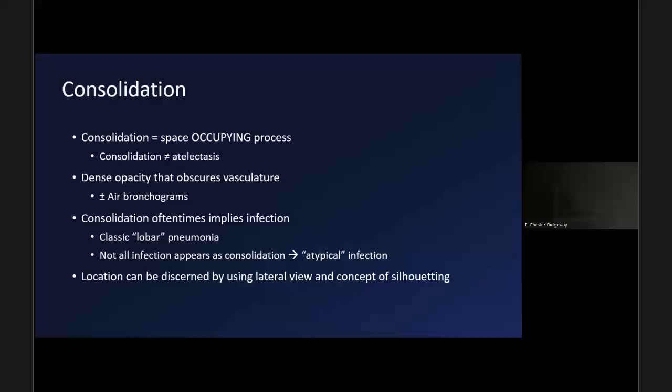So just a quick step back, consolidation as opposed to just some other opacity, it's a very dense opacity. It obscures the underlying vasculature.